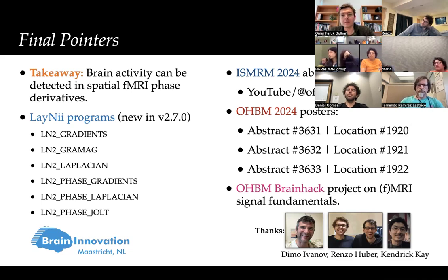Connectivity, you mean like literally like correlation between two boxes? Conductivity, I'm sorry. Conductivity. Okay, sorry, I was thinking connectivity. Yeah, because it seems like, again, maybe you could relate the phase jolt to conductivity. And again, I'd love to understand the sequence, as you said, maybe it's something about the short echo time, maybe it's something about it being bSSFP.